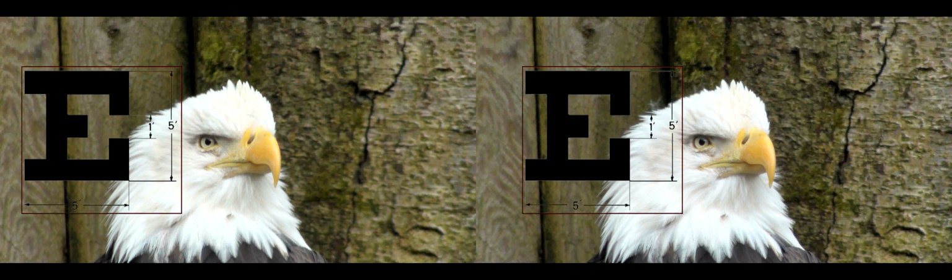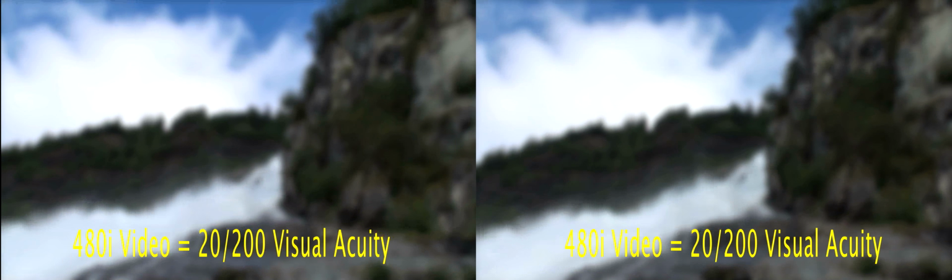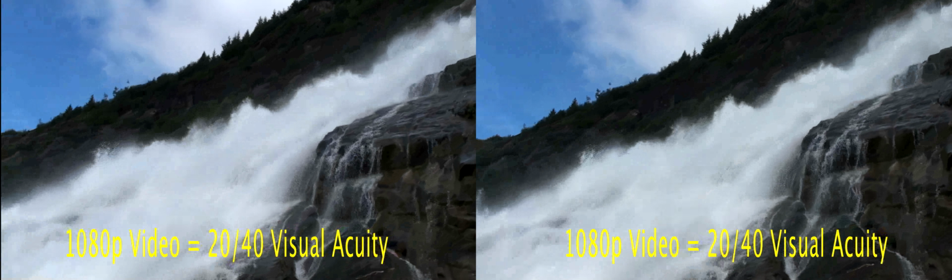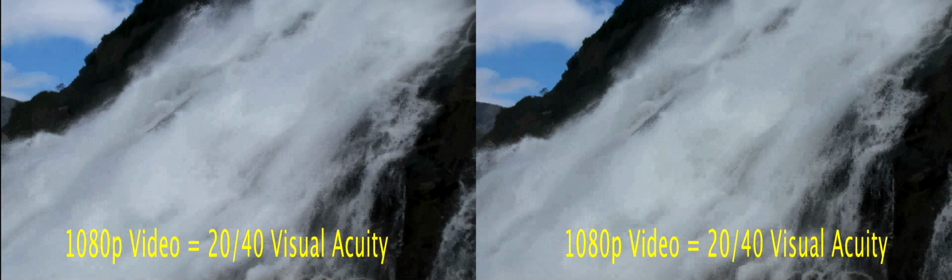20/20 visual acuity represents an angular resolving capacity of 1 minute of arc. Video microscopy is set up to mimic the Galilean geometry of the microscope, with a field of view of about 30 degrees. In this scenario, the pixel density of 480i interlaced video yields 20/200 equivalent visual acuity, but 1080p high-definition video yields pixel density equivalent to 20/40 vision. This is an absolutely essential principle because high-grade depth perception is a direct product of 2D image resolution.